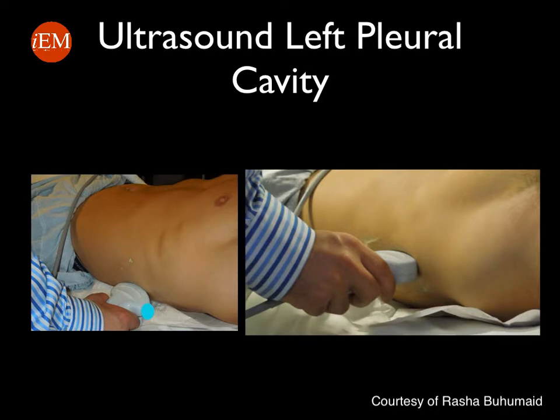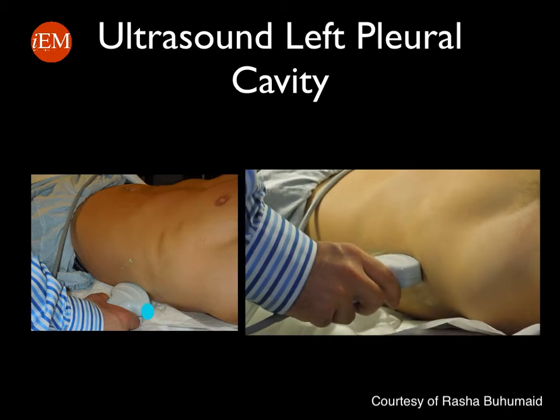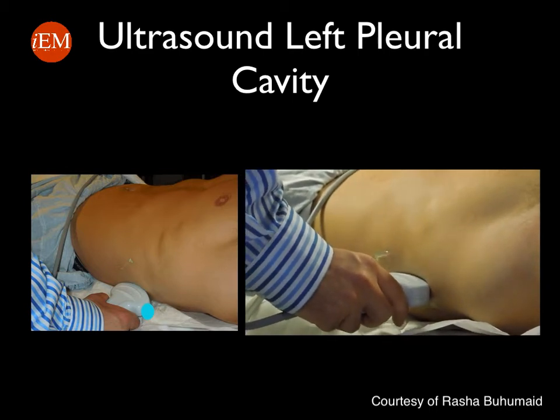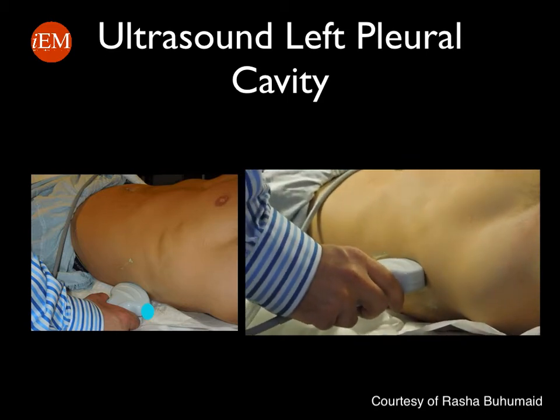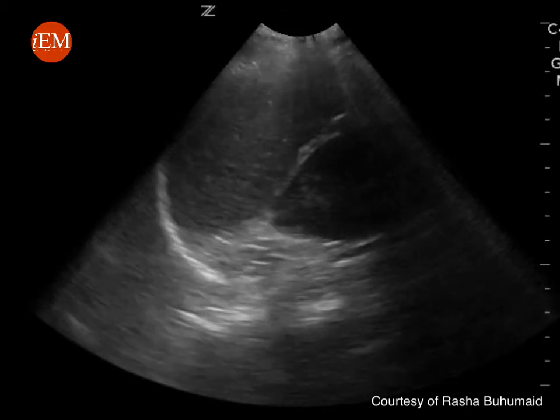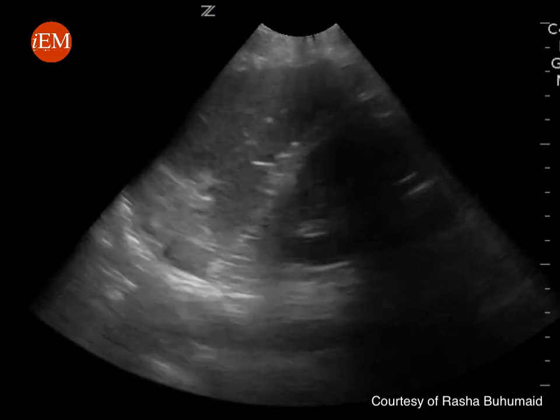You will perform the same imaging technique to evaluate the left pleural cavity. The only difference is that you will place the probe coronally and more posteriorly, so that your knuckles are touching the bed. Then move the probe more cephalad with the probe marker towards the patient's head, and interrogate the area just above the diaphragm looking for any signs of pleural effusion. This is the ultrasound image you will try to obtain.